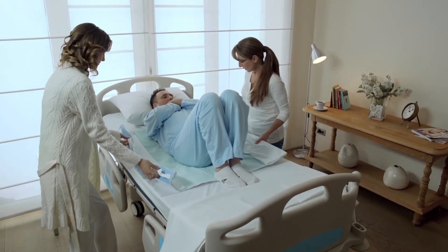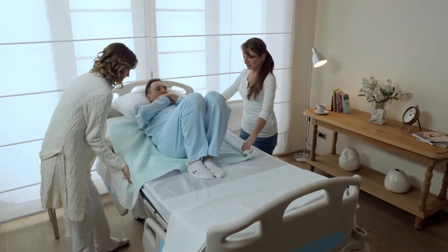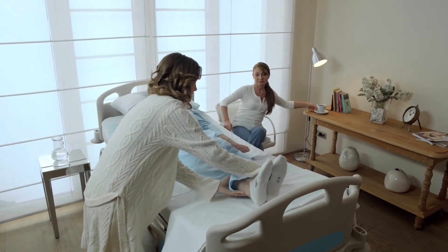While moving, gently slide the patient in the movement direction rather than putting load on your waist. Positioning the patient in a single movement will eliminate the risk of injuries for caregivers and the patient.